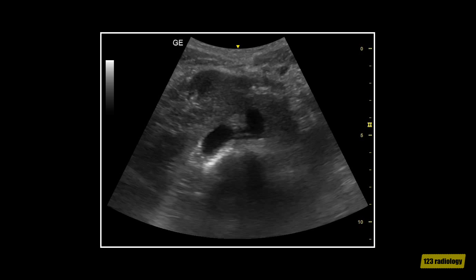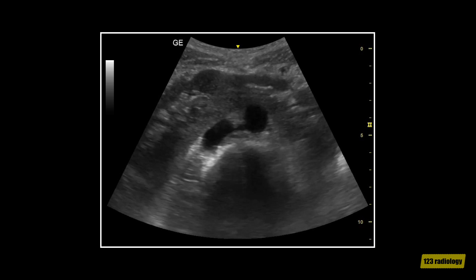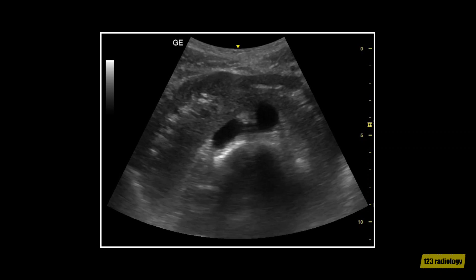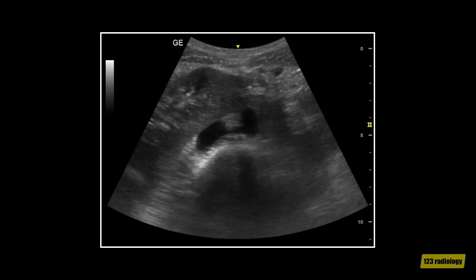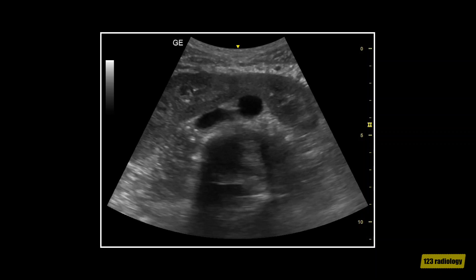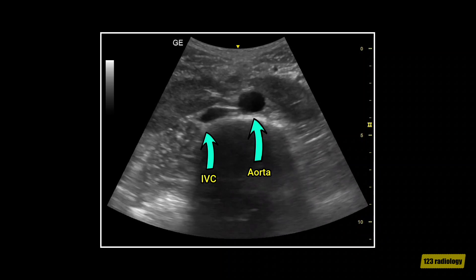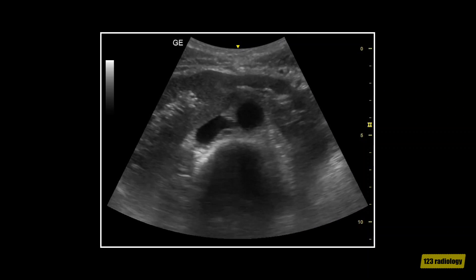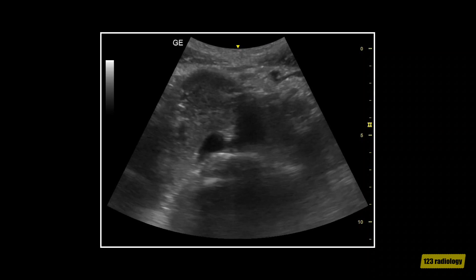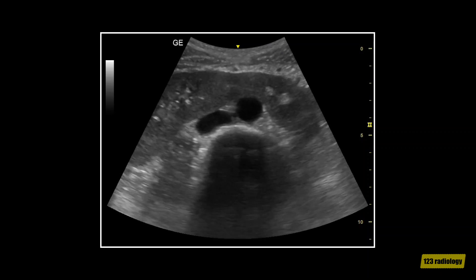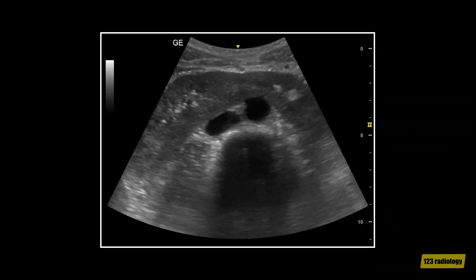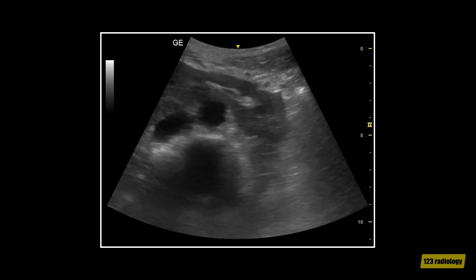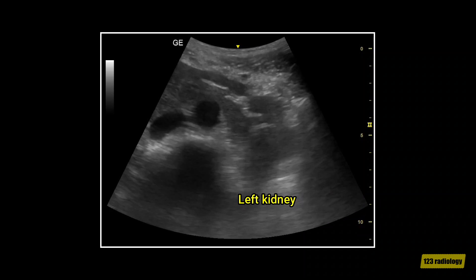This is a transverse view of the midline in the same patient. It shows a horseshoe kidney. The isthmus of the horseshoe kidney is seen anterior to the aorta and inferior vena cava. The isthmus in this case is composed of thick functioning renal tissue. This is the right kidney and this is the left kidney.